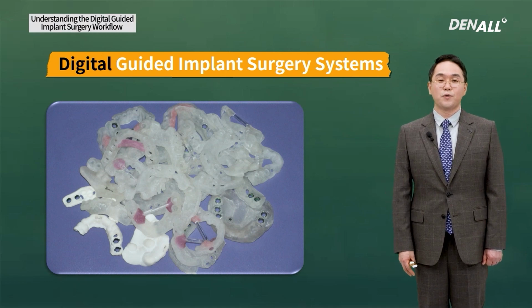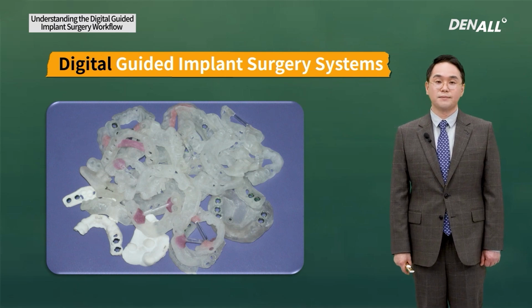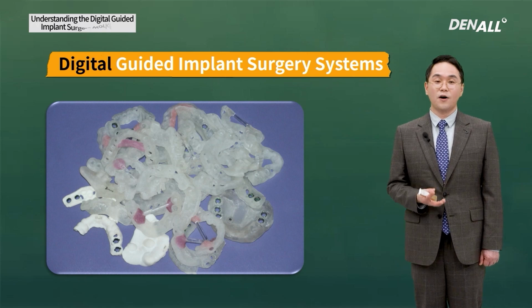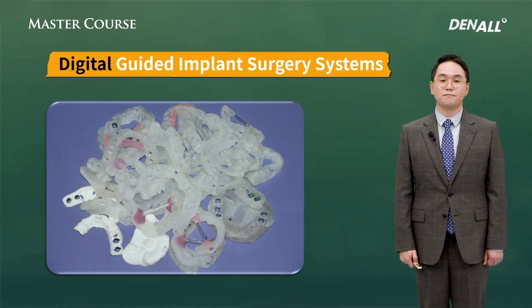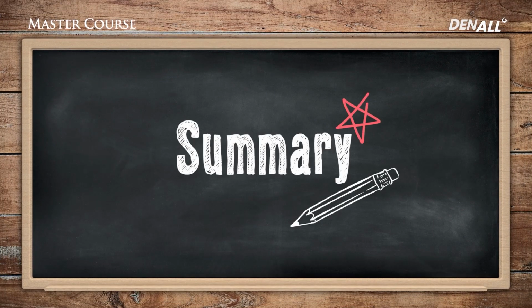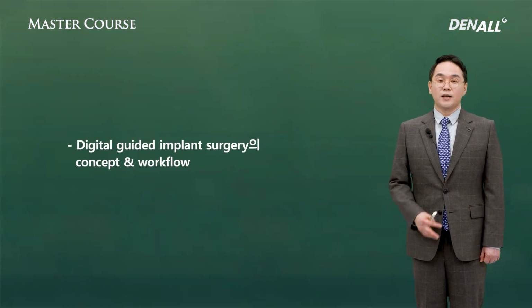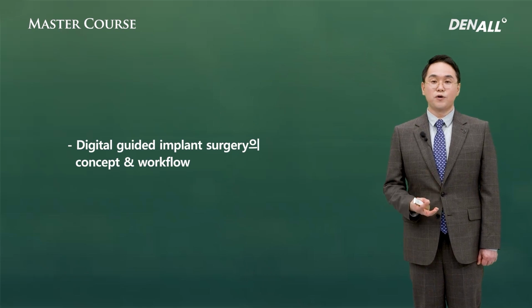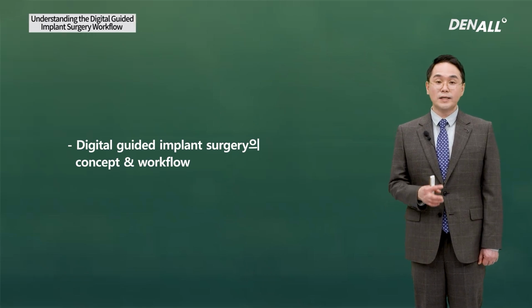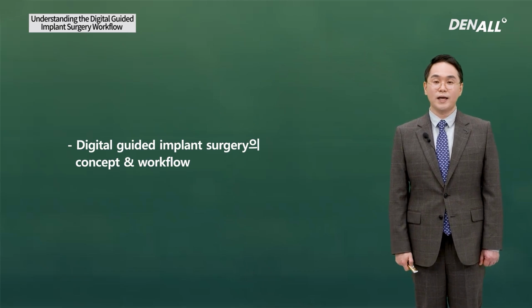The guide hole sizes and systems used would be different from company to company, and you need to understand the differences to do digital guided surgery properly. We looked at the overall digital guided implant surgery workflow. When we understand the workflow accurately, we can reduce the errors to the minimum from the beginning.